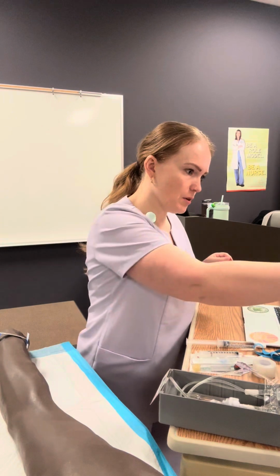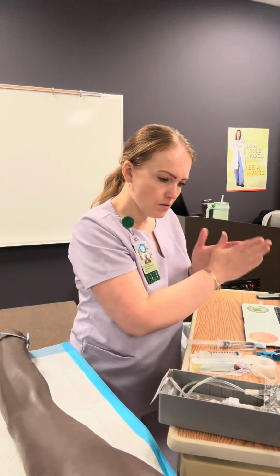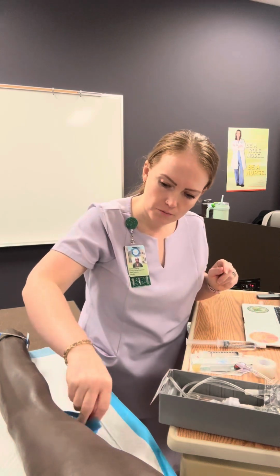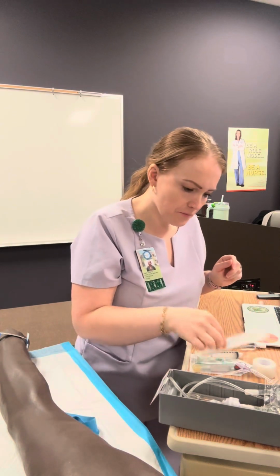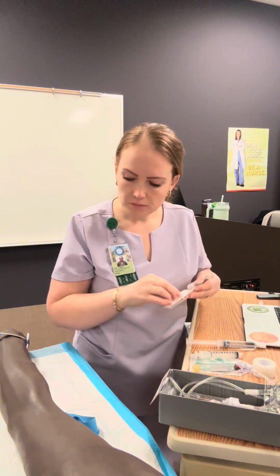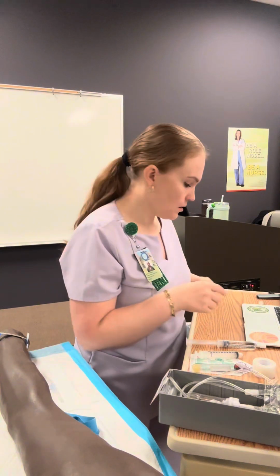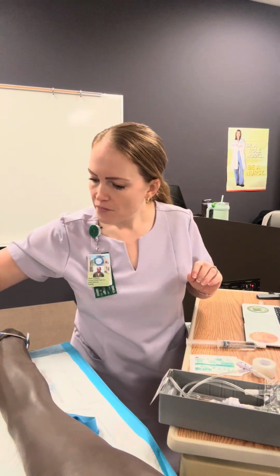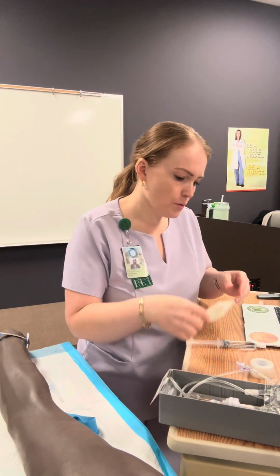In preparation, I'm going to perform hand hygiene. I do that every time I walk into a patient's room. I get my tourniquet right next to this patient, and get my IV catheter open and ready to go next to the patient here. I like to throw away my stuff as I go. I have my syringe and my blood collection tube prepared.